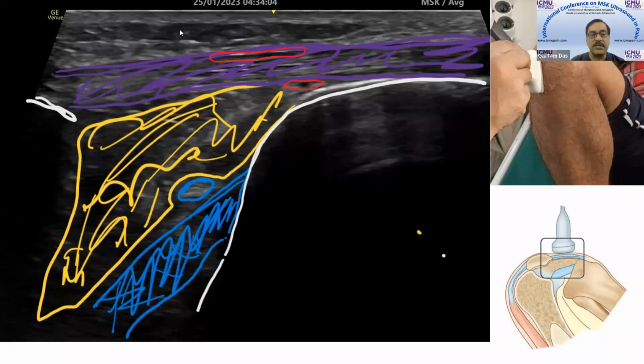Normally it lies approximately 2 centimeters below the skin, and just below and posterior, the anterior cruciate ligament starts and goes. It looks hypoechoic, bounded by 1 or 2 hyperechoic lines, and your knee should be maximally flexed.